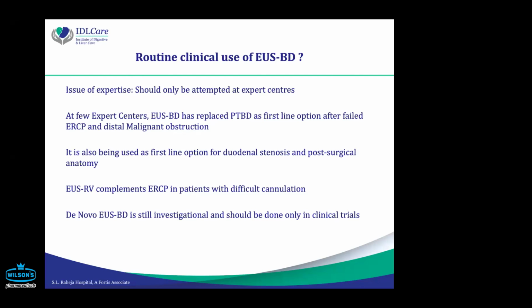But if you do not have expertise, please learn first because there can be severe complications. At a few expert centers, EUSBD has replaced PTBD as a first line option after failed ERCP. PTBD has diminished considerably at our center. Probably in a year we are doing one or two, that too for very advanced hilar blocks. Otherwise, all the other work we do with EUSBD.